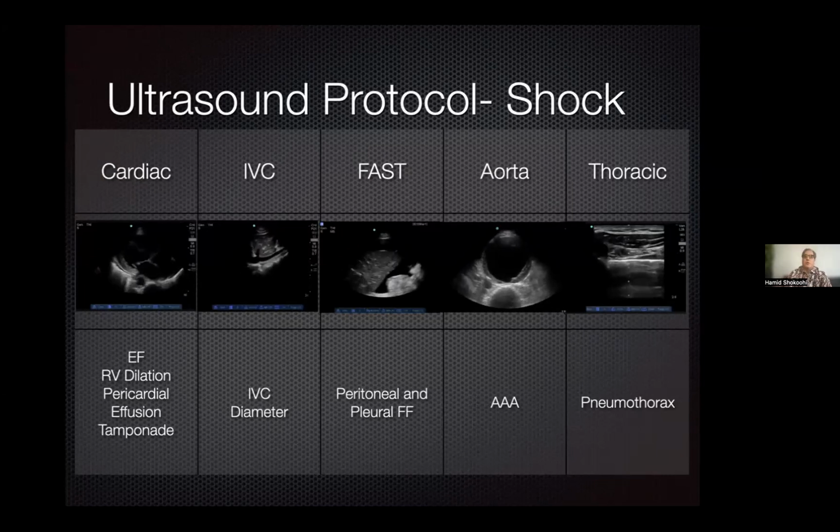Like the storage of water in your house, you look and say, okay, the storage is full, so probably they are good and the circulation may happen. But what if I tell you that the hose sending the water is leaking, because the patient has sepsis? How can that IVC represent the volume status for this patient? So those are the downsides of the IVC. But still we use it because it gives you some component of the information about the volume status.